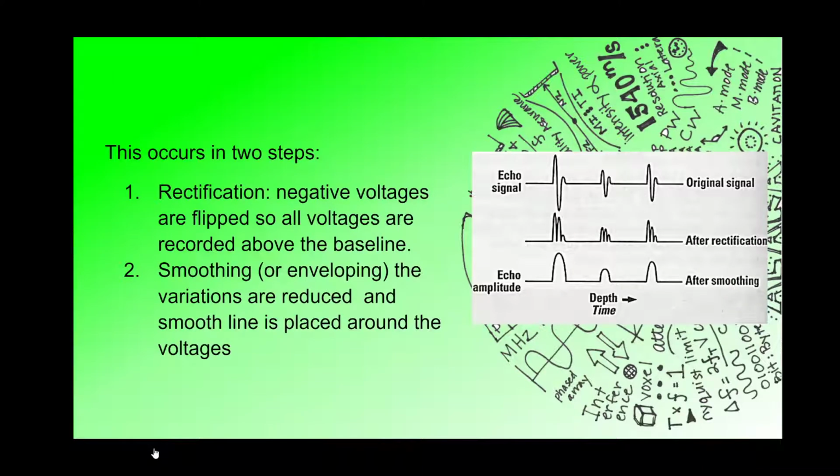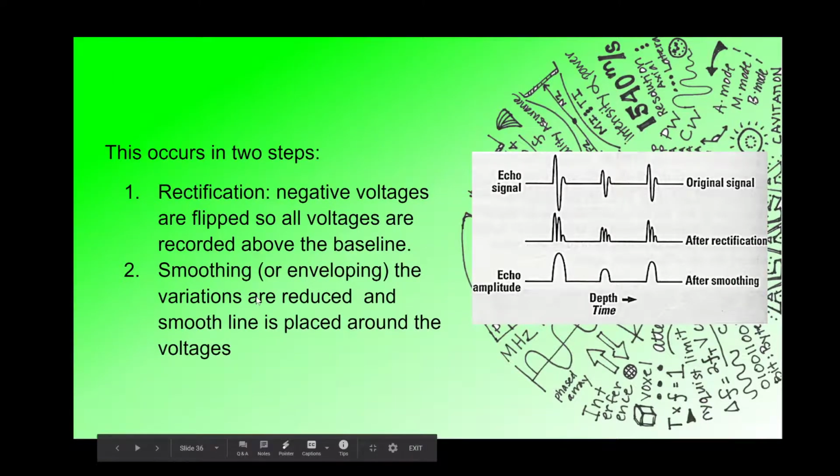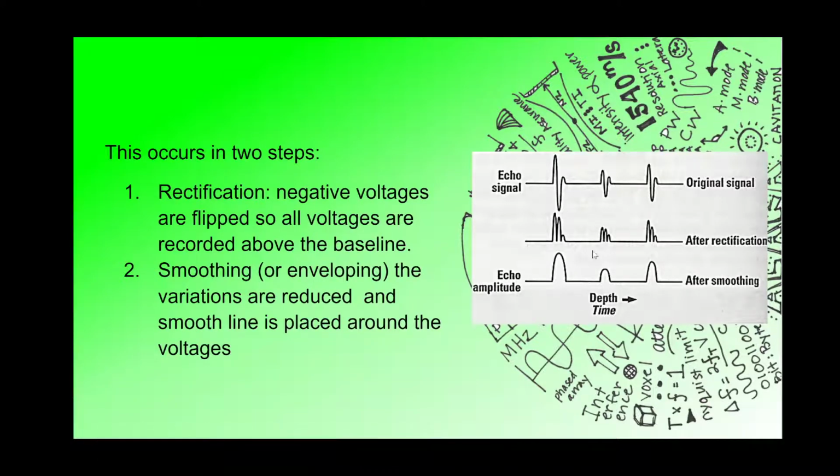With demodulation, two steps must occur. The first one is rectification. Basically, rectification takes anything that's below the baseline and just flips it above the baseline. So now you get these weird lumps all on one side of the baseline. That is rectification: flipping negatives into positives. The next thing that occurs during demodulation is smoothing or enveloping. It takes the average of what's happening with those pulses and makes it one line of information.